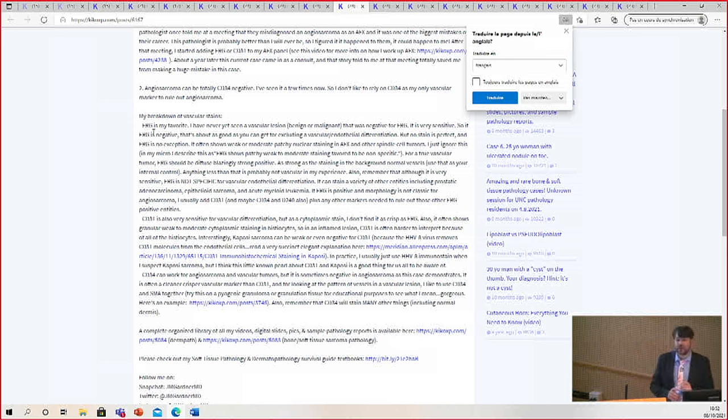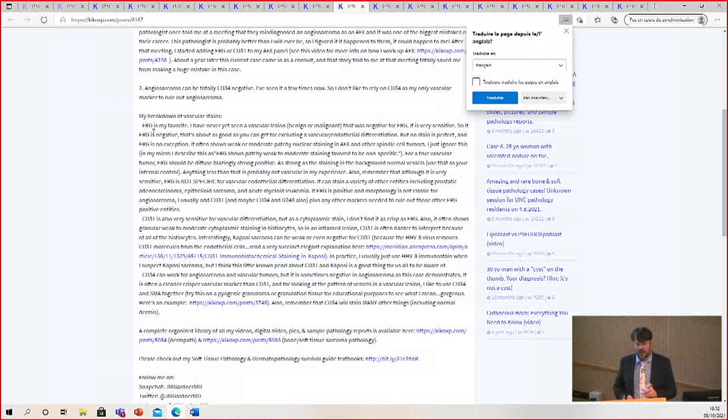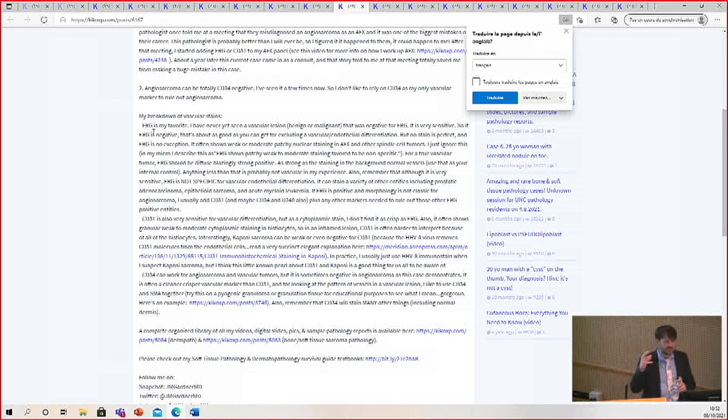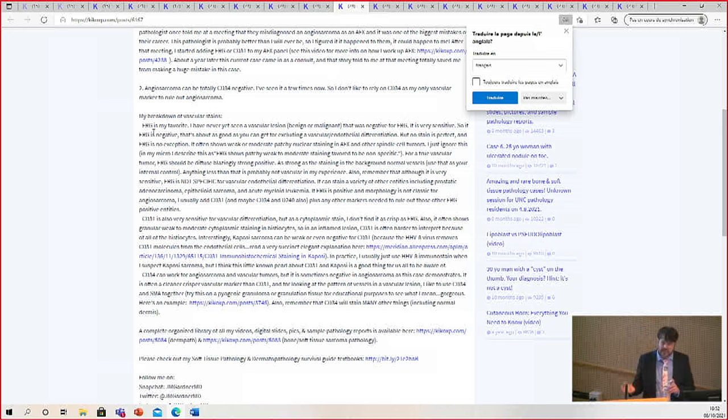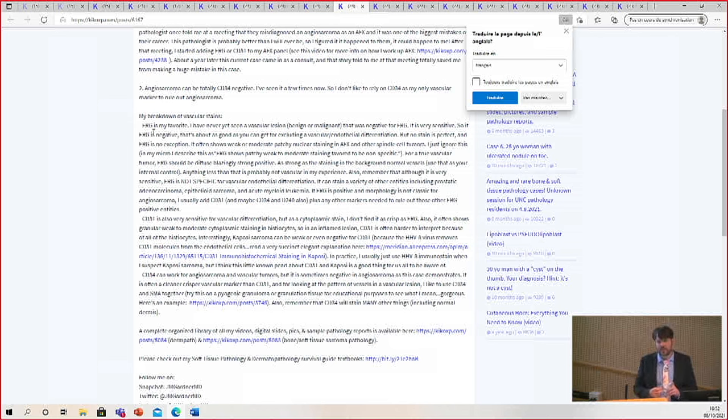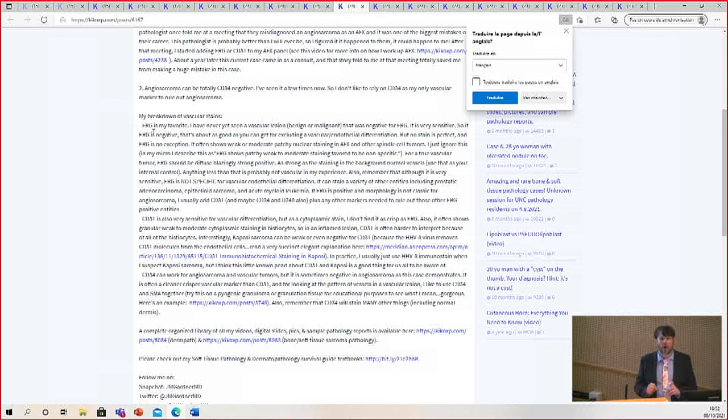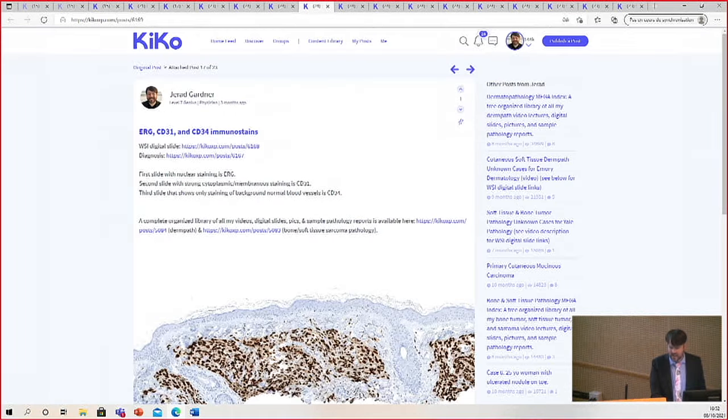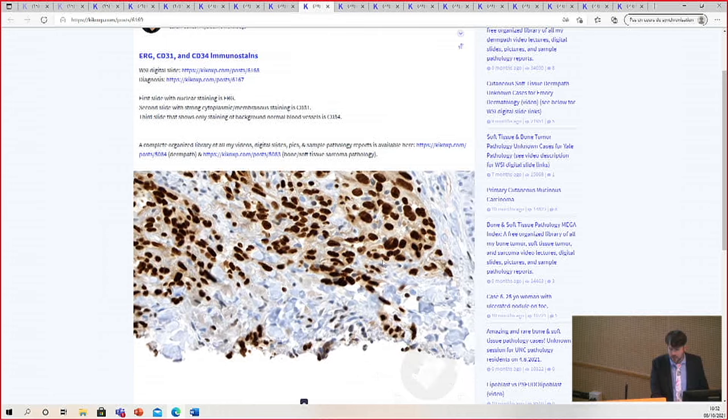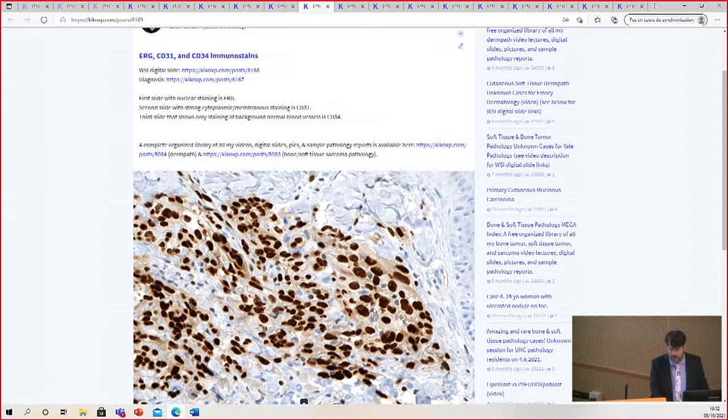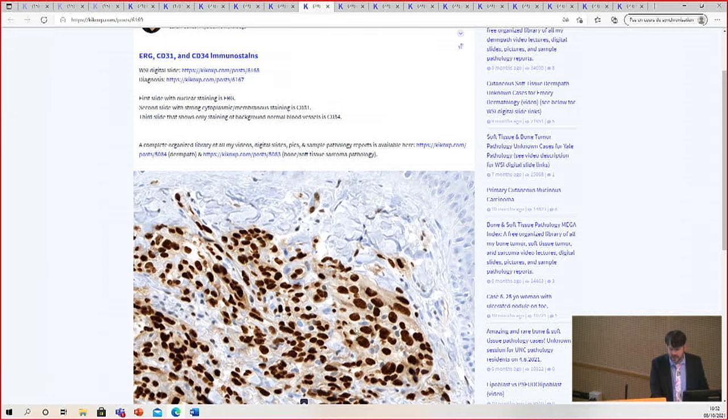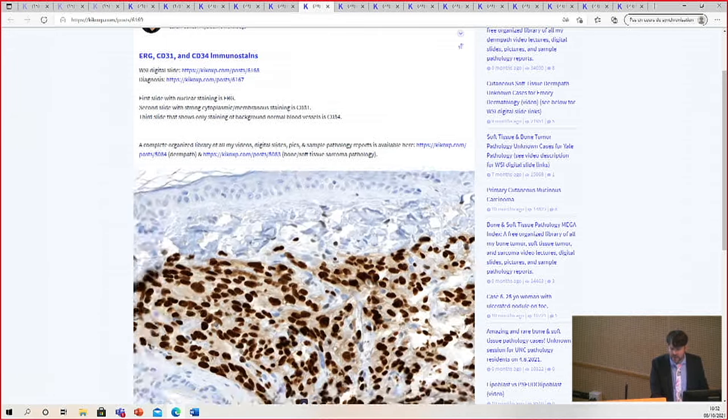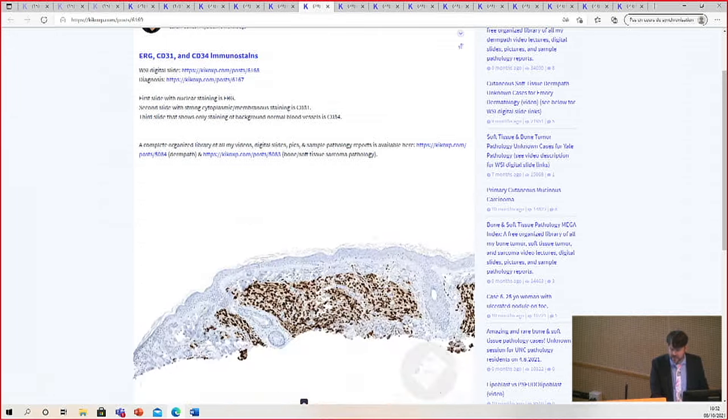CD31 is very sensitive, but it is not quite as crisp and clean sometimes. It will stain histiocytes, usually with weak granular staining. But in a tumor that's very inflamed and has a high background histiocyte concentration, CD31 may not be the best choice because it will be dirty, hard to read. And what I want as my normal internal control when looking at a vascular tumor - the tumor cells should be as strong as the background blood vessels.